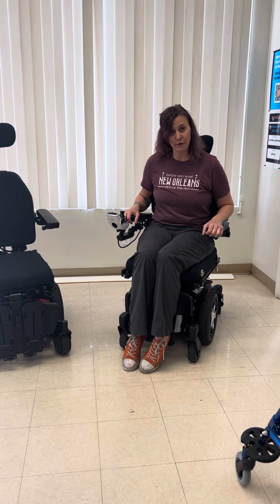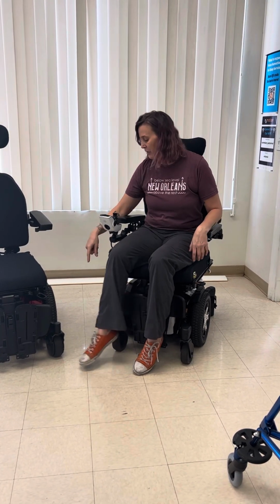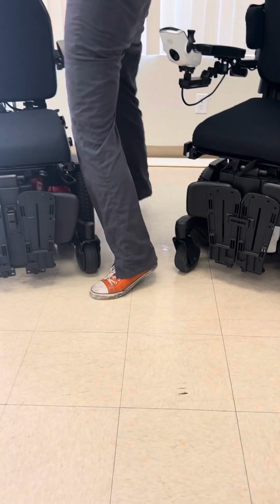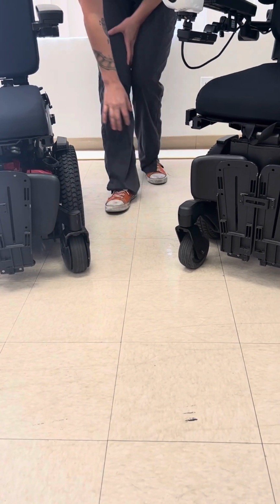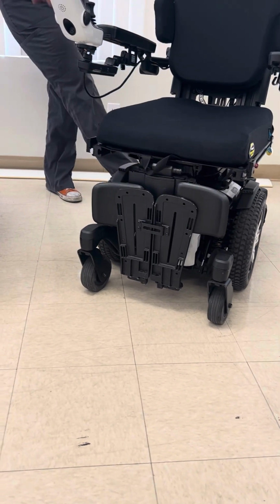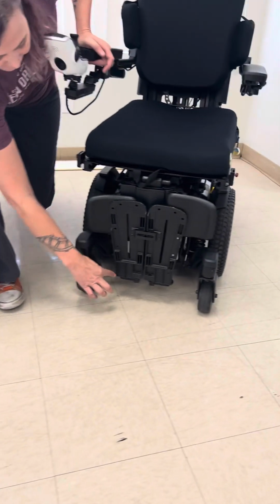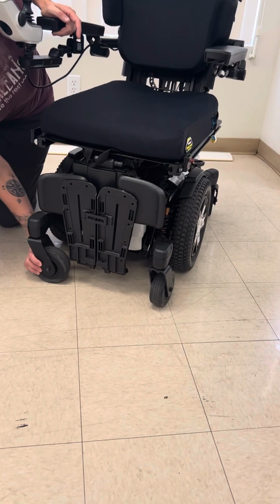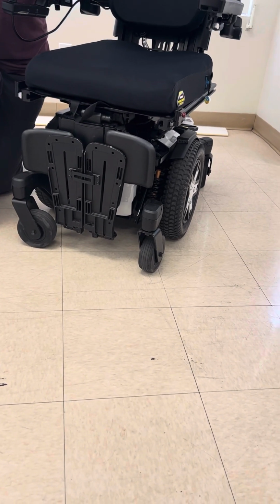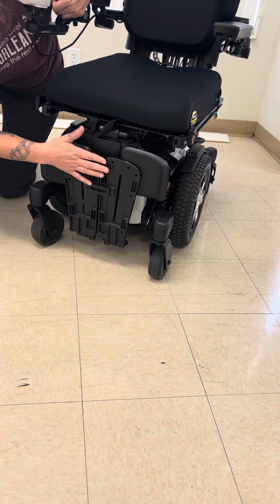Some of the key differences is the caster wheels are a little bit different. So the standard caster wheels, those are the wheels that roll in the direction of movement but do not have a motor attached to them. These are 6 inches in diameter and they're on the front and the back, okay? On the Stretto, we actually do have the 6 inches on the back, but on the front, we have to have 5 inches. And that's because of the clearance between the wheel being able to turn and the foot plate. So that's another factor. If you have some stuff as far as leg supports going on, you want to make sure that that will be functional for you as far as your feet position.